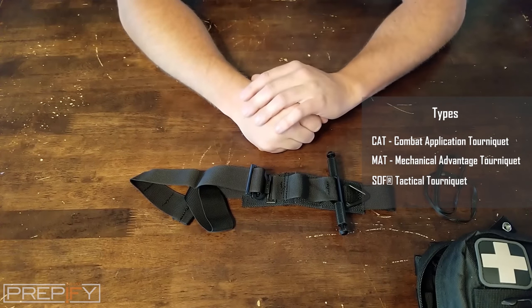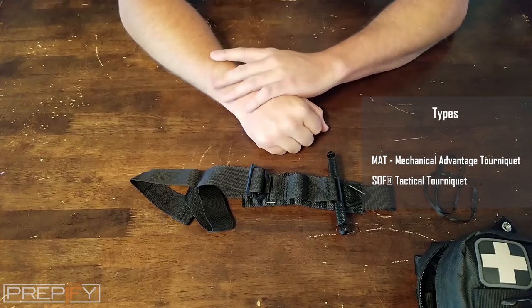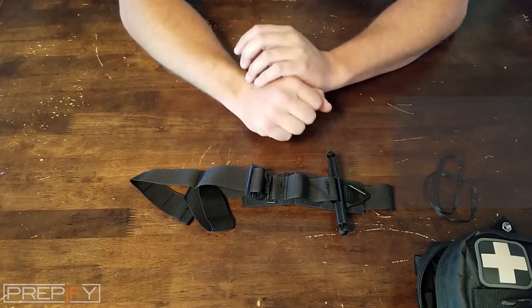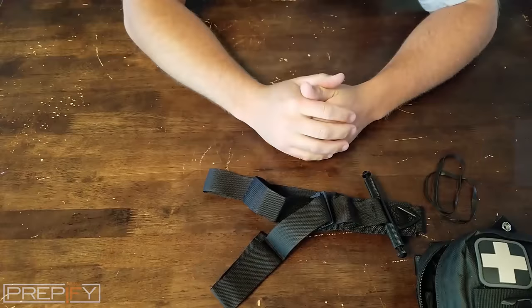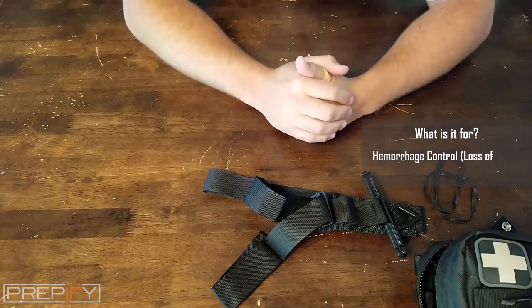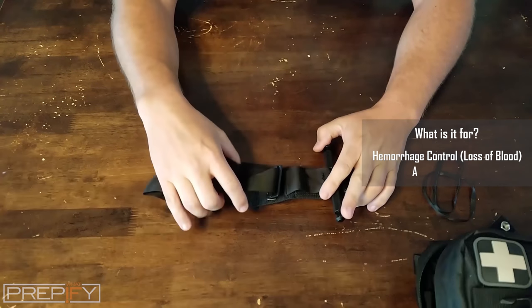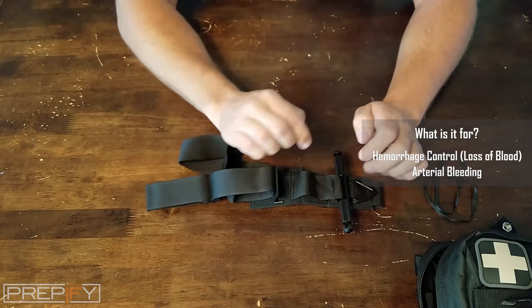Practice makes perfect — it should be muscle memory when putting these on, because when you're watching blood spurting out of your body, you're going to be having some crazy thoughts and you'll be in a hurry. A tourniquet is used for hemorrhage control, stopping bleeding. The main use is for arterial bleeding, when you have that spurting of blood.